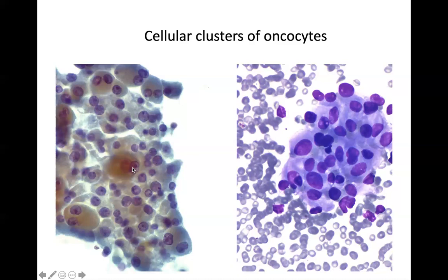And so some of you are typing Hürthle cell neoplasm in the comments, some are voting. All right, so exactly. So Hürthle cell neoplasm, Hürthle cell lesion is in the context of a follicular neoplasm cytologically. So the nuclear features that you see in Hürthle cells, in oncocytes, should not be taken to represent the atypia that might direct you to a papillary carcinoma, right?